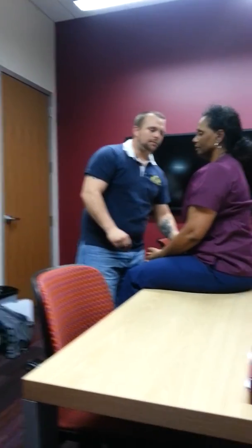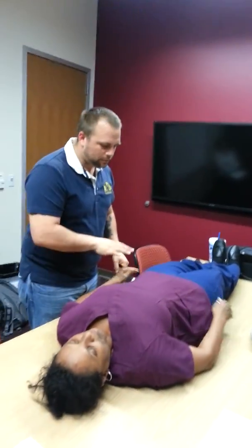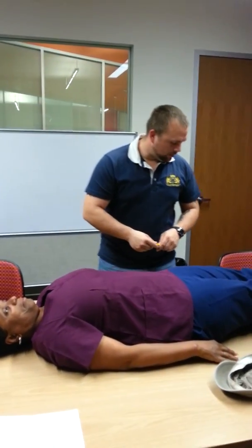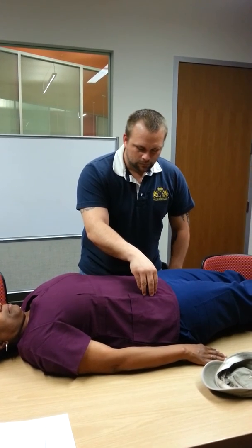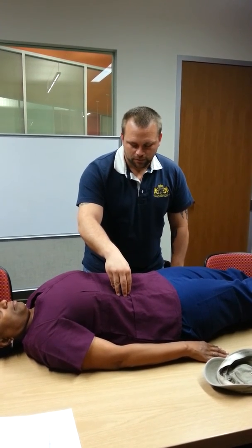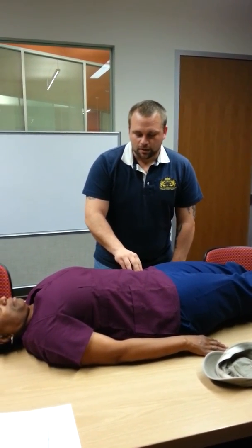Alright, now I'm going to go ahead and have you lay down on the bed for me. I'm going to go ahead and inspect her abdomen. Her abdomen is not bulging, it's symmetrical. I'm going to listen to all four quadrants, starting at the right lower quadrant, listening for active bowel sounds. 15 seconds in each quadrant, unless no bowel sounds are heard, then it would be 1 minute in each quadrant. Alright, so I have active bowel sounds in all four quadrants.